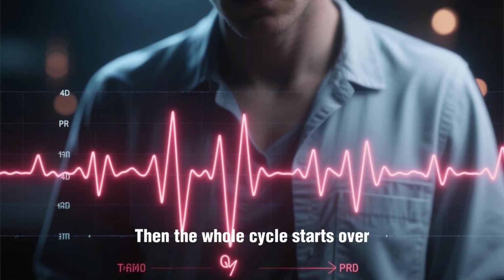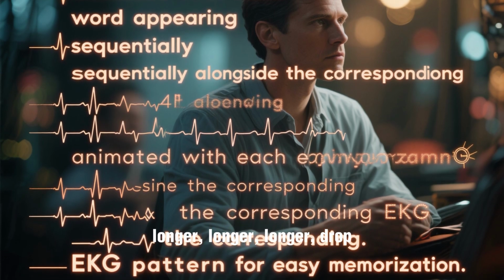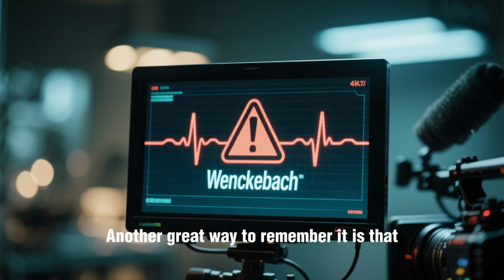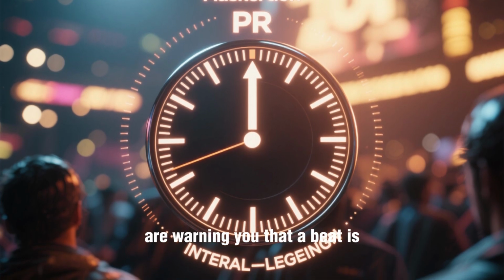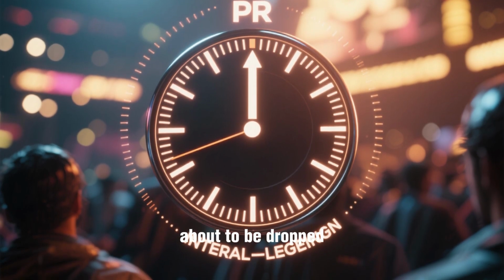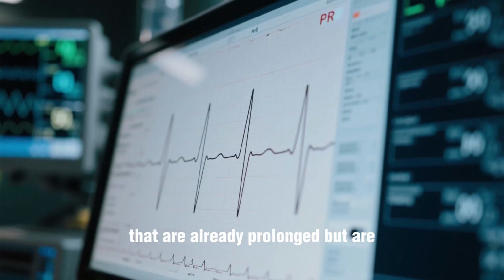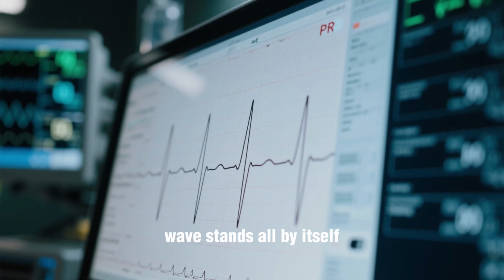Then the whole cycle starts over. The classic mnemonic for this is longer, longer, longer, drop. Another great way to remember it is that Wenckebach gives you a warning. The gradually lengthening PR intervals are warning you that a beat is about to be dropped. So, on the EKG, look for PR intervals that are already prolonged, but are stretching out even more before a P wave stands all by itself.